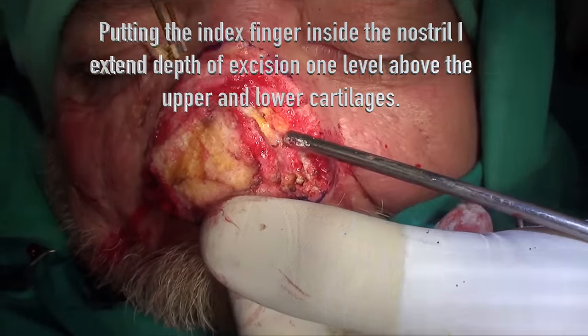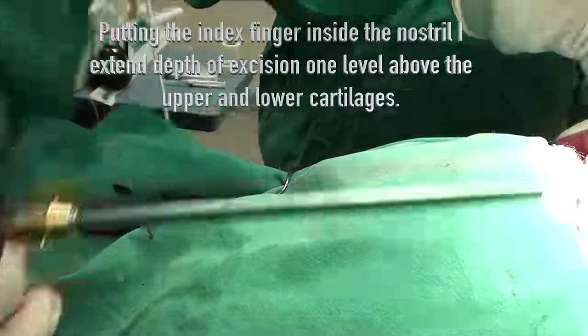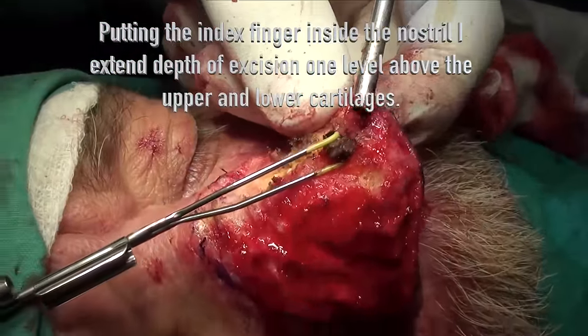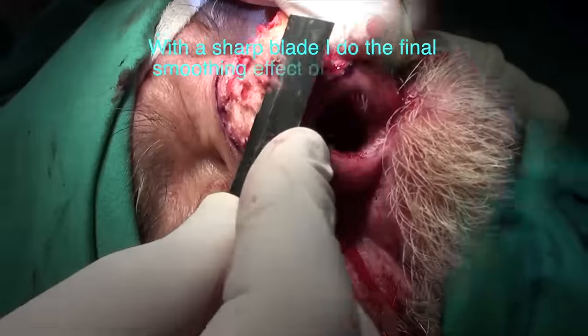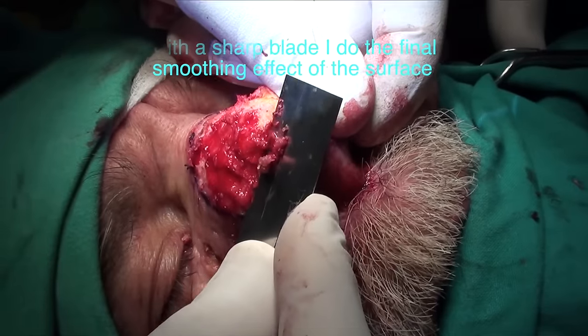I extend the depth of excision one level above the upper and lower cartilage. With a sharp blade, I do the final smoothing effect of the surface. Before and after in one case.